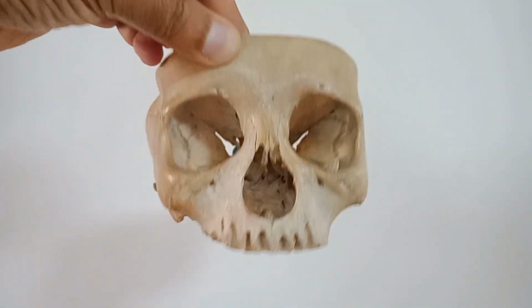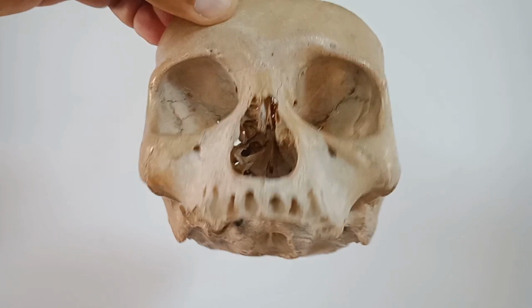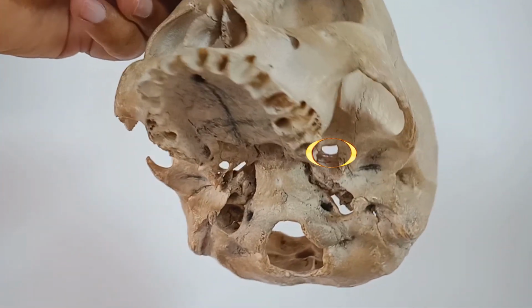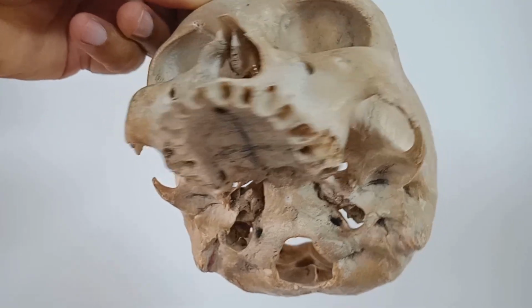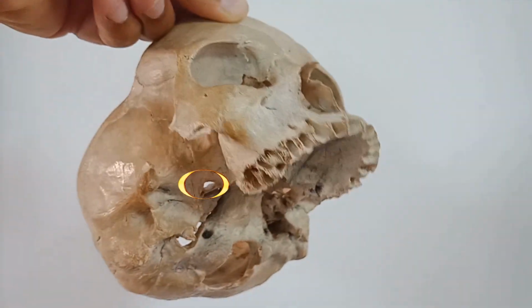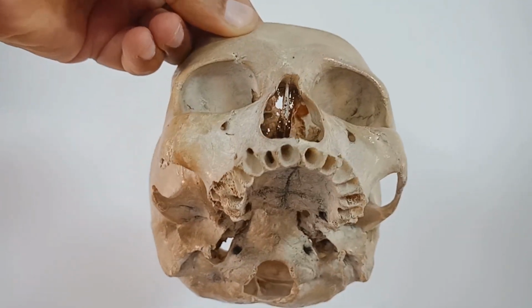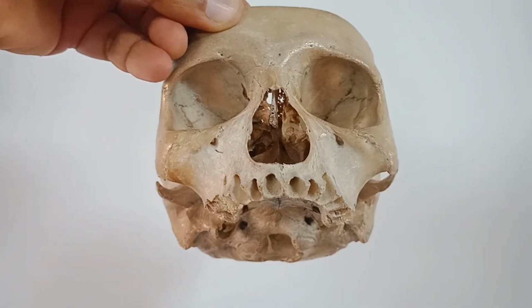So again, AP, submental, and oblique. Submental and oblique, we can see this. So in this way, we have to focus the foramen ovale.